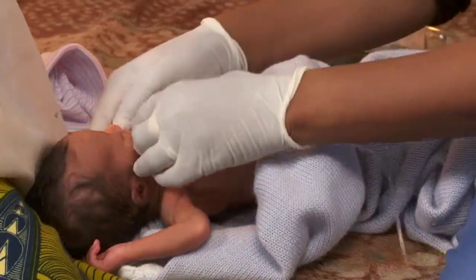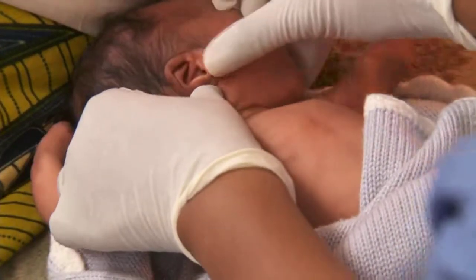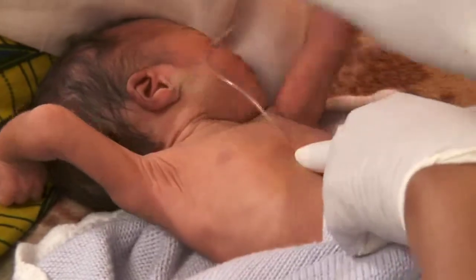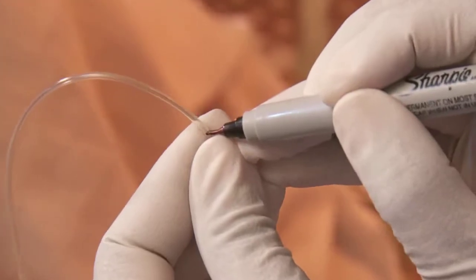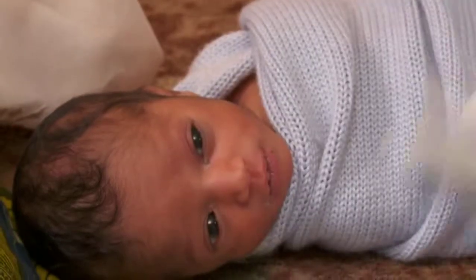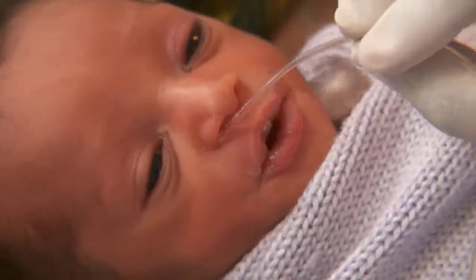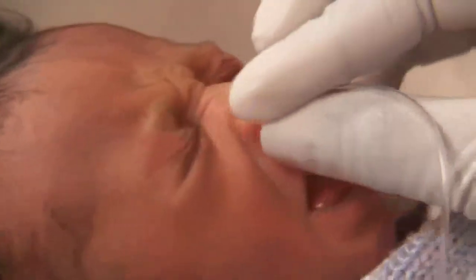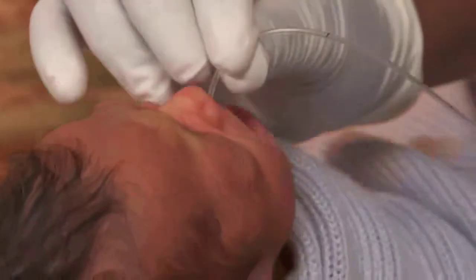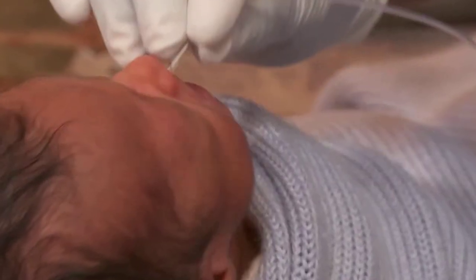Next, measure the length of the tube to be inserted. Put the end of the tube on the baby's nose. Stretch it to the earlobe, then to the base of the sternum. Mark the length. Hold the baby's head still and flex his neck forward slightly. Gently insert the tube slowly and steadily. Aim toward the back of the head until you've reached your mark.